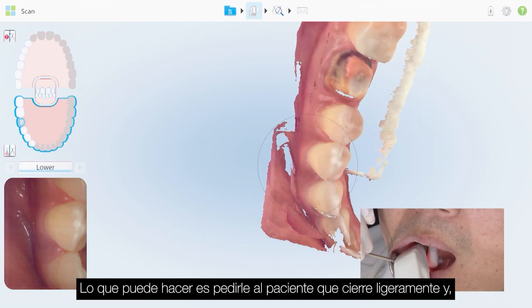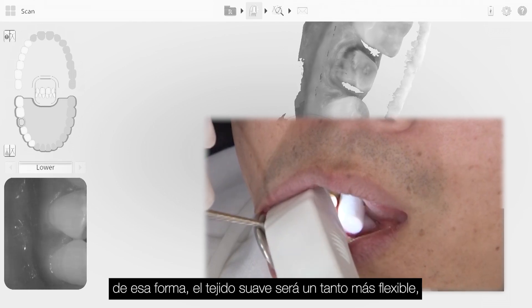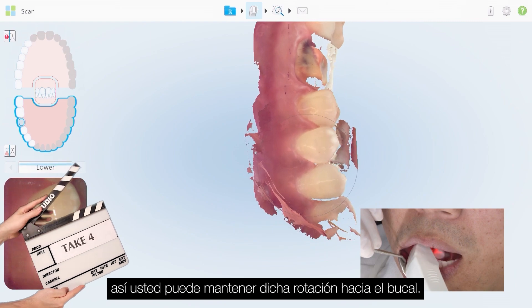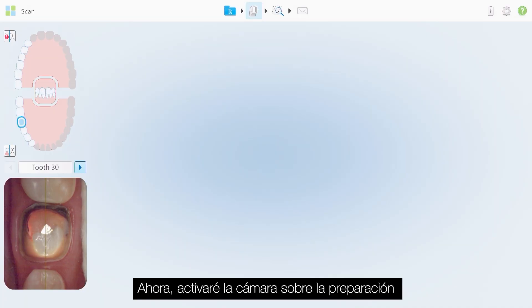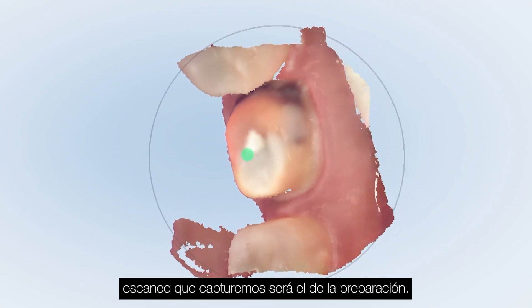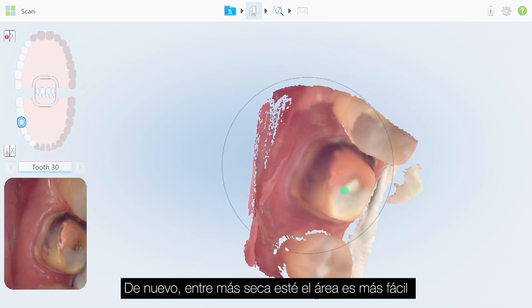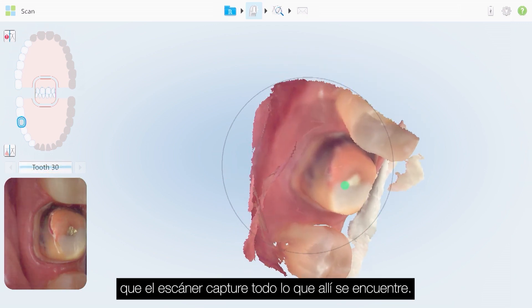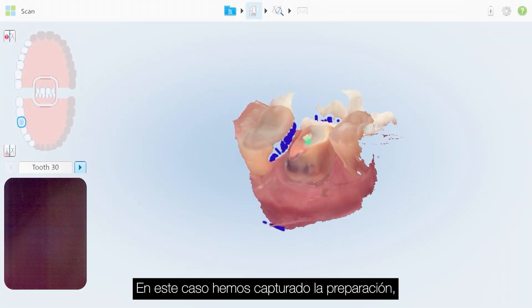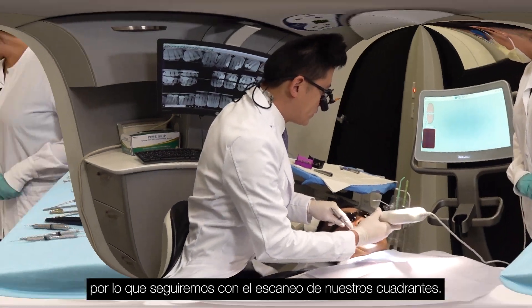What can also help is to ask the patient to close slightly — just a little bit — so the soft tissue is a little more movable. Now I'll activate the camera over the preparation. In this case with the iTero Element, the first scan we capture will be of the preparation. The more dry the area is, the easier the scanner will capture the site. Now we've captured the preparation.